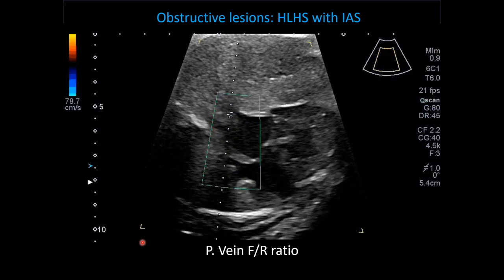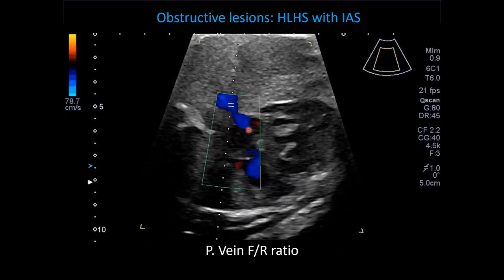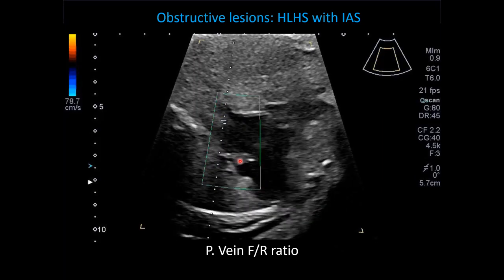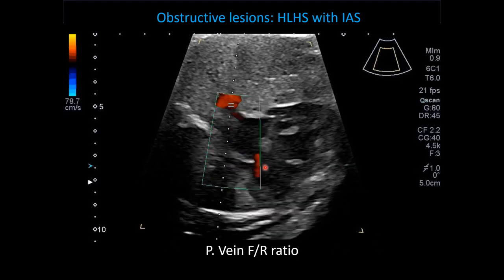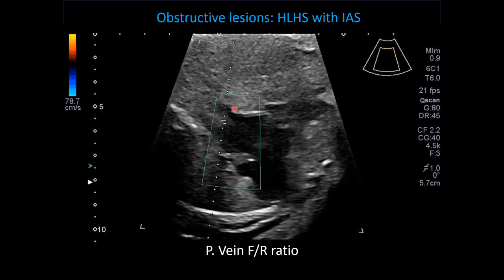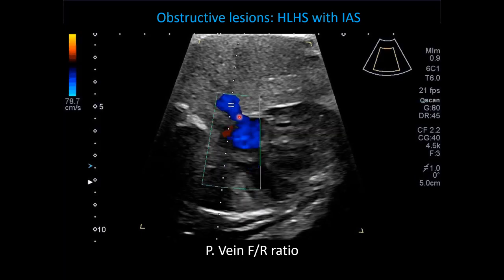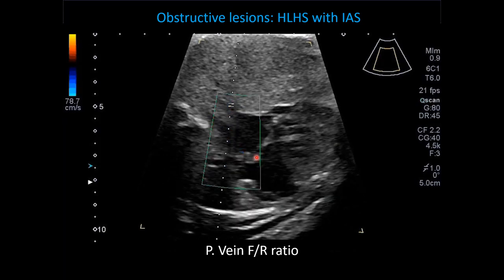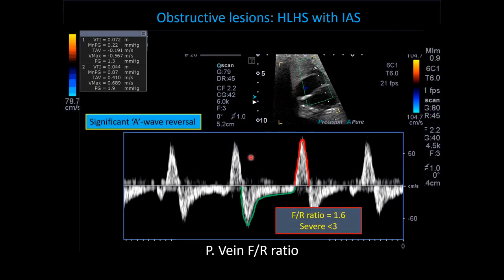In this second case of hypoplastic left heart syndrome, you see a single right ventricle and right atrium, with the atrial septum bowing from left to right — an abnormal finding. Color Doppler of the left pulmonary vein shows to-and-fro flow in both colors, indicating possible restrictive atrial septum. Pulse Doppler of that pulmonary vein confirms a highly abnormal forward-to-reverse ratio of 1.6 with significant atrial reversal during atrial pulsations — well within the severe range, where severe is defined as less than 3.